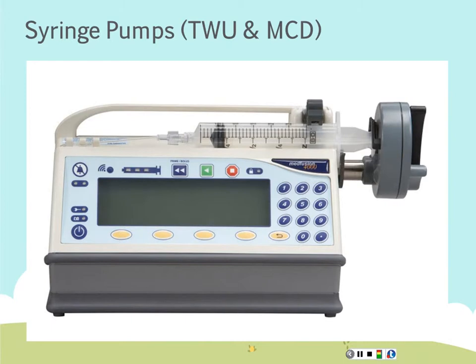When we're working with infants and young children, they're at a much increased risk of fluid volume overload compared with adults. We talked about this a little bit with our enteral feeds. When you're looking at those insertion sites, we've got the small veins and things like that. So malfunction of that IV insertion site, infiltration, pulling it out, or pulling it back too far can cause a lot more damage and injury in a child more quickly than it would in an adult. So we have to really monitor IV fluids carefully.